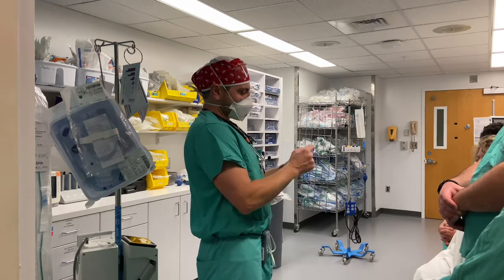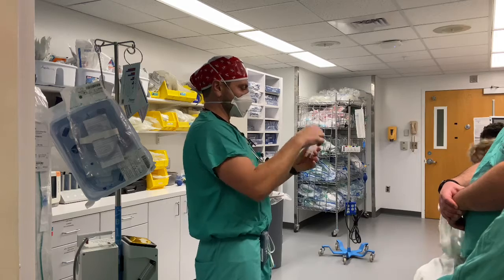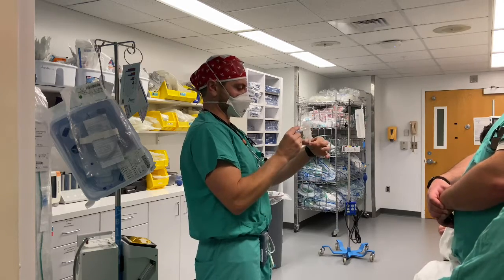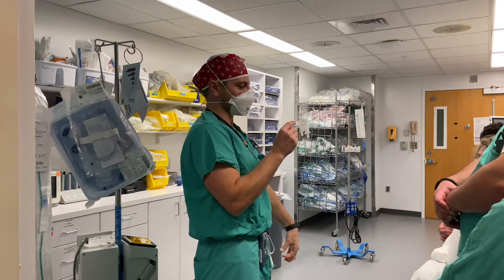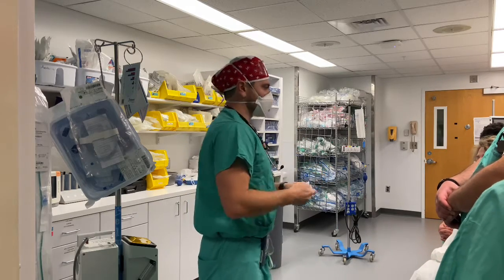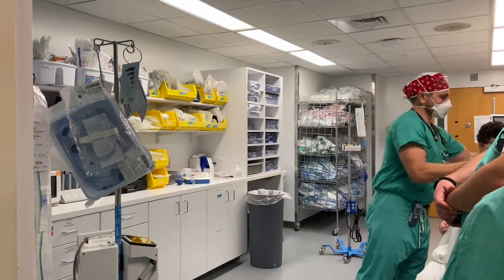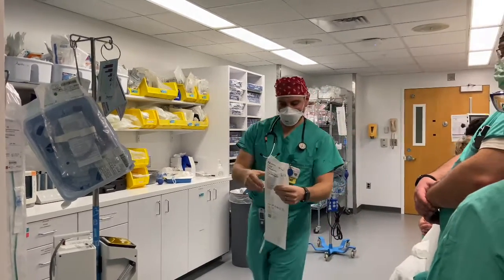All right, so this gets connected to the ventilator. Okay, fresh gas flow goes this direction, and if you don't do anything else, it just blows down both sides of the double lumen tube. We've already opened up this kit. I'm just going to use it.